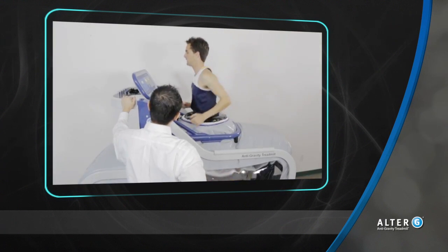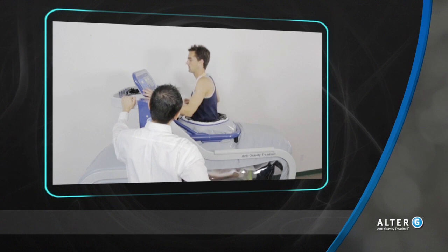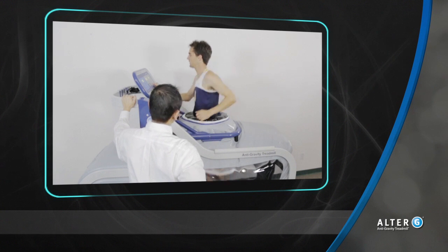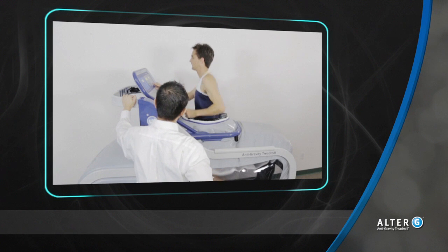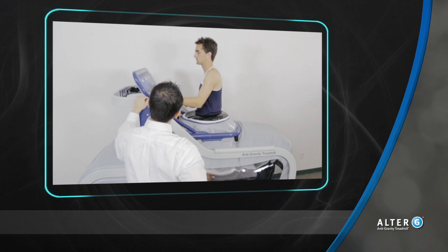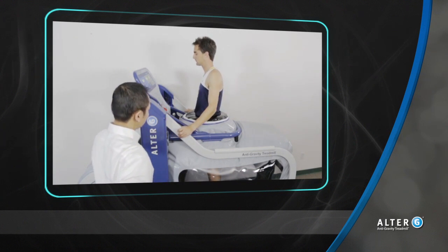Do not decrease body weight support further if the patient complains of pain. It is recommended that patients stay at the same body weight level at subsequent sessions if there is residual soreness after using the Alter-G. If the patient is pain-free, they can add more body weight at the next session, but in no more than 10% increments.